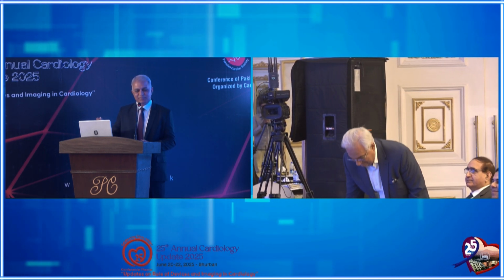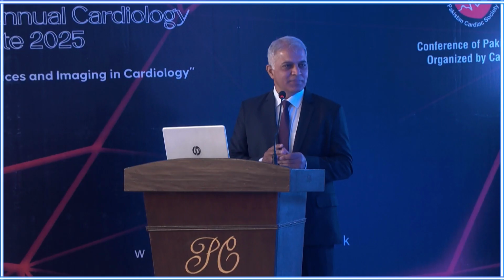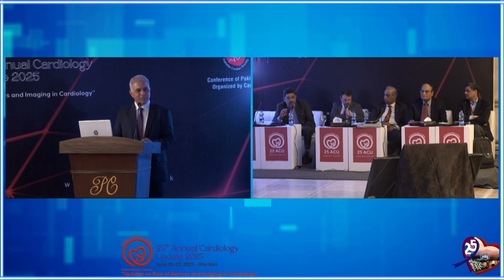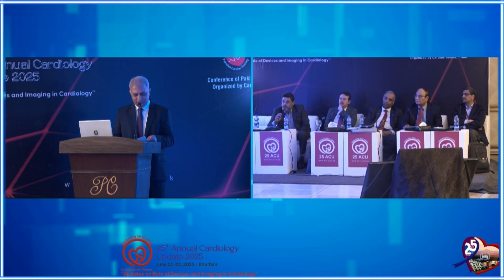So very nice presentation. 2 quick comments. First, one should always try to objectively risk stratify the chances of losing the side branch by applying DEFINITION II criteria, and if possible the RESOLVE criteria, so that one can decide whether it's a simple or a complex bifurcation requiring an upfront 2 stent strategy.